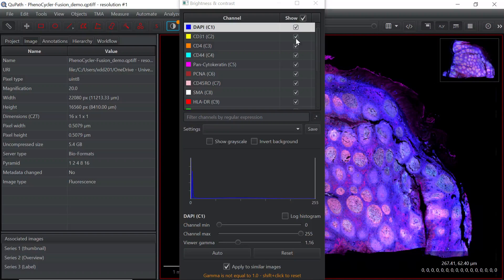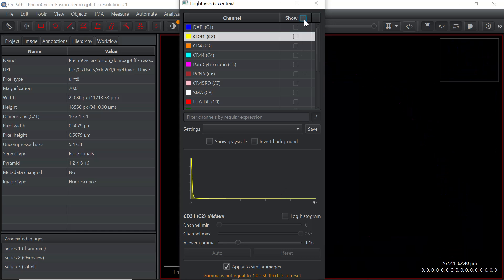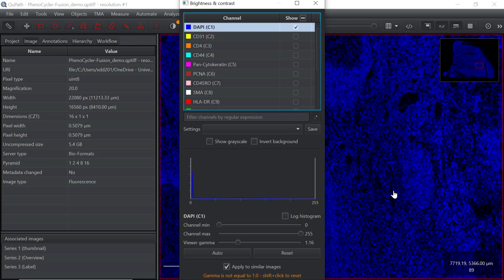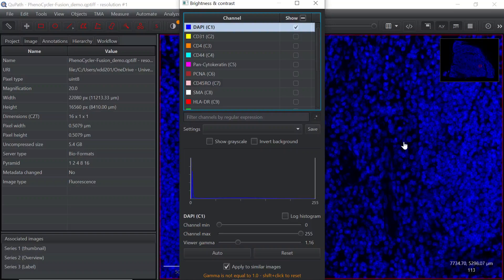You can click the toggle button to switch on or off for each channel. For example, we can switch off the CD31 channel. Then if you click DAPI, you can see just the DAPI channel. We can make the image bigger and see individual cell nuclei.